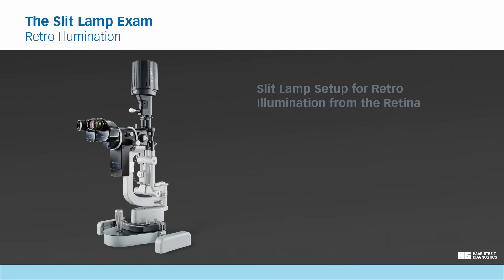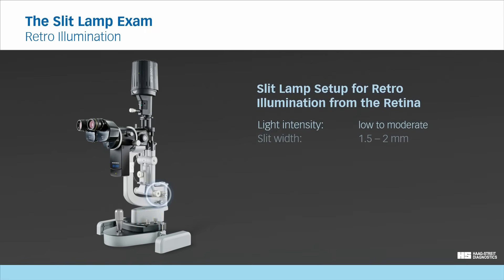When the retina is used for retroillumination, choose a low to moderate light intensity and a slit width of about 2 mm. Set the illumination angle between 0 and 10 degrees. Choose a magnification of 10 times and zoom in if required.